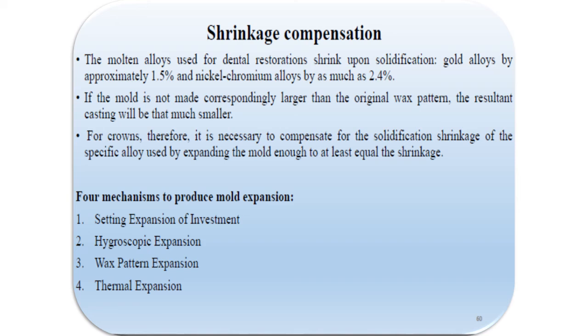So, keeping in mind the solidification nature of the metal, the mold or the investment material we use needs to expand correspondingly.